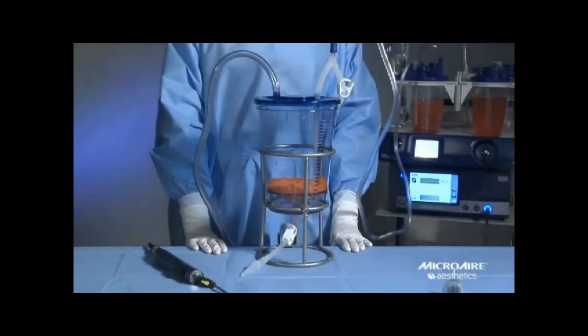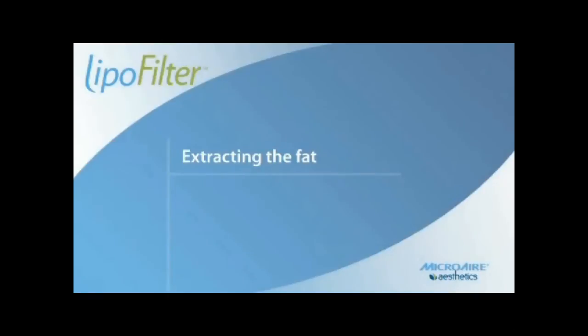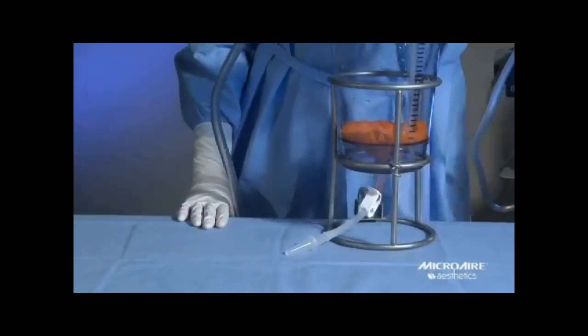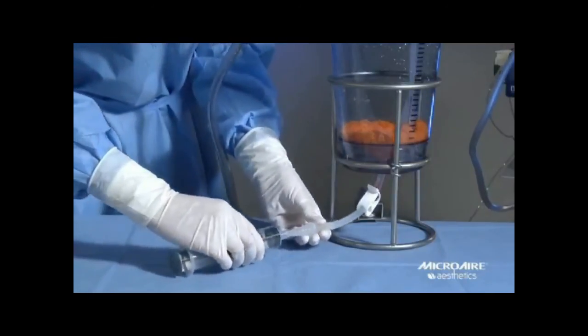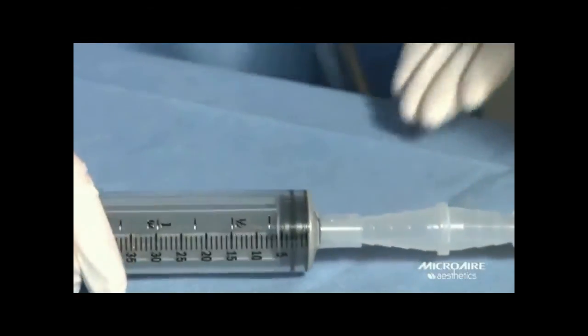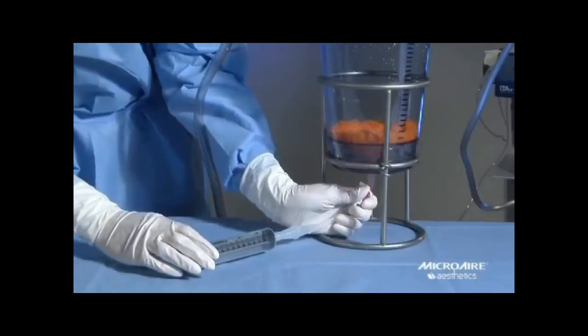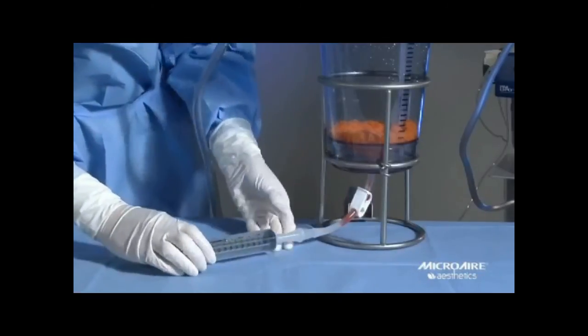To extract the fat, connect the tomy syringe to the fat evacuation tube. Push the syringe on until you feel it click. Open the lower pinch clamp and draw out the residual fluid that remains in the stem and discard.